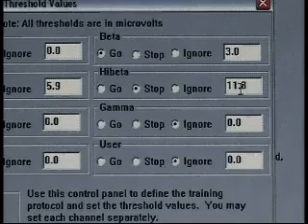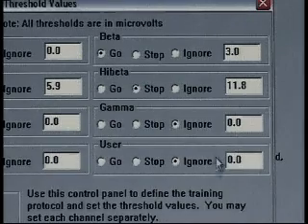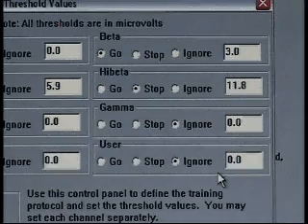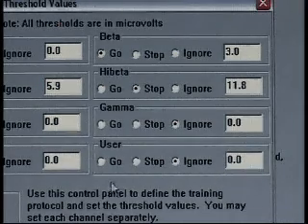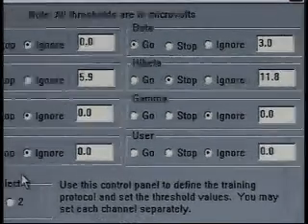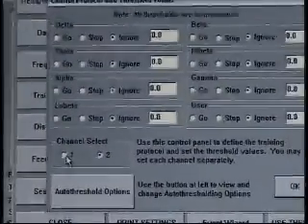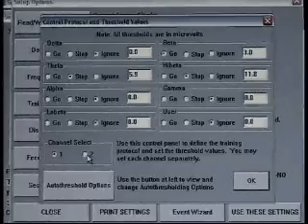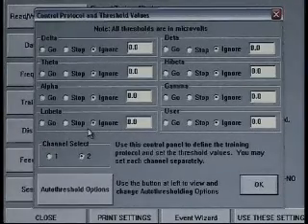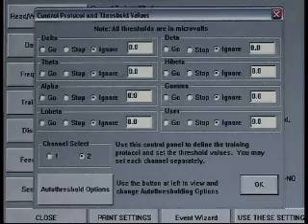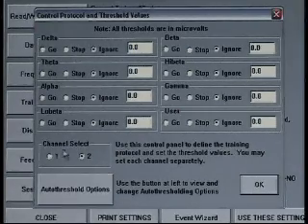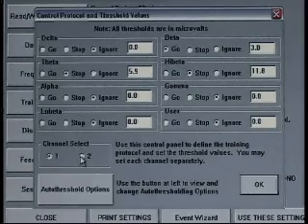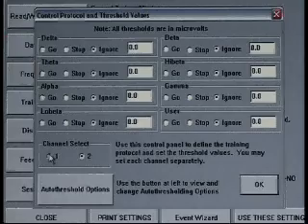But we'll reset after baseline as the new session begins. As we look at gamma, we see ignore. User, we see ignore. If this happened to be a two-channel protocol, as we scroll back over to the left, we see a channel selector box. As I toggle between 1 and 2, you'll notice that on channel 2 everything's on ignore. If this was a two-channel protocol, you could independently set up a second protocol in this channel or you could mirror channel 1. But as I go back to channel 1, I see my stop on theta. As I go to channel 2, I see it's on ignore because we're not doing anything with channel 2 this particular protocol, so I leave it on channel 1.